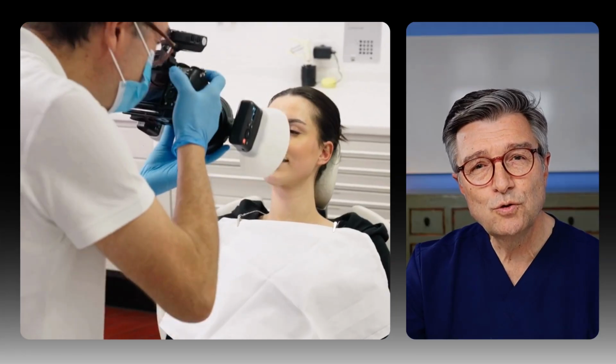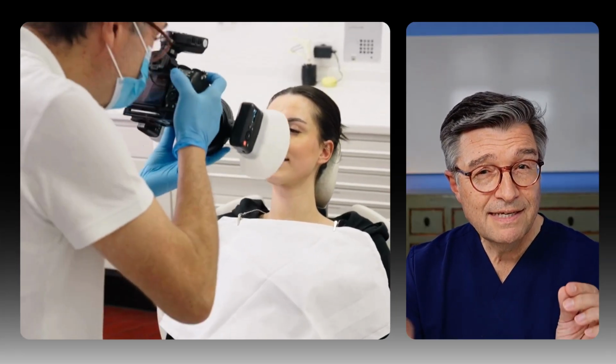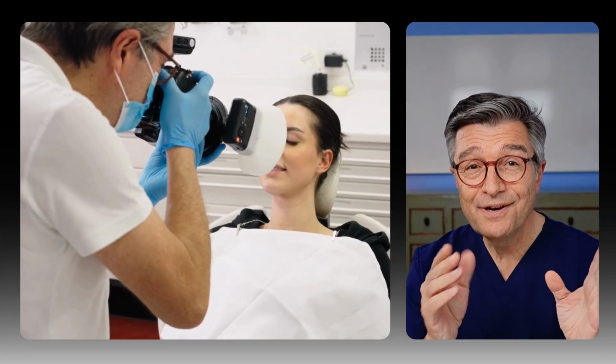It allows us to document cases comprehensively, capture fine details like shade, texture, and soft tissue health. Here, the side remark, be careful using diffusers and softboxes to not lose these details. You can monitor changes over time. For that, we need standards, a standardized protocol, to communicate with labs and specialists. Every treatment plan should begin and end with a standardized photo series.